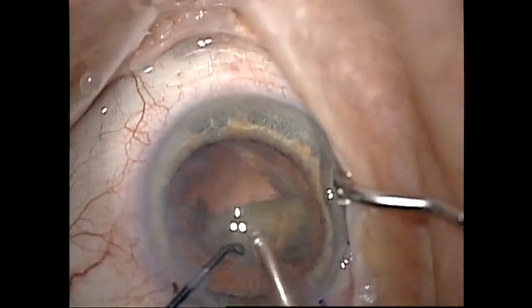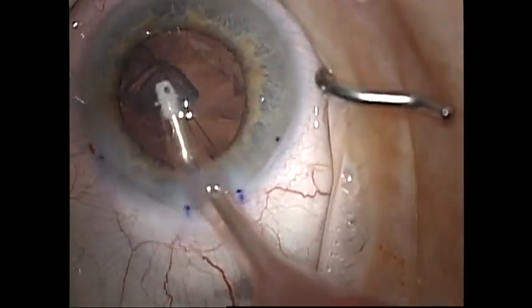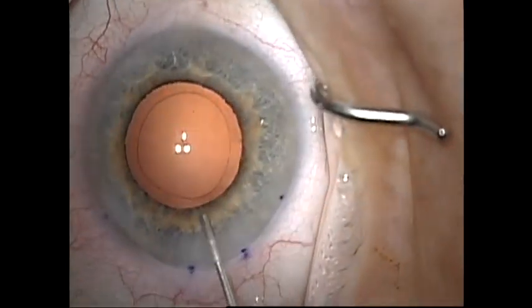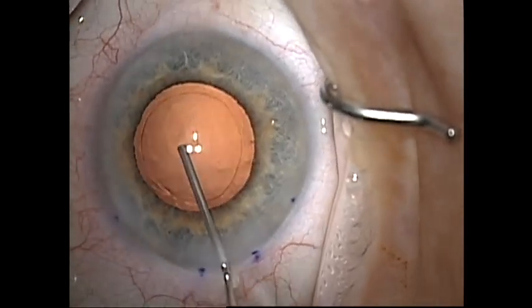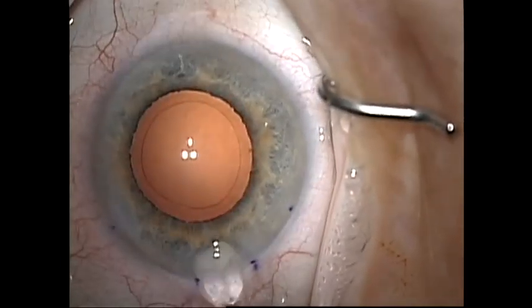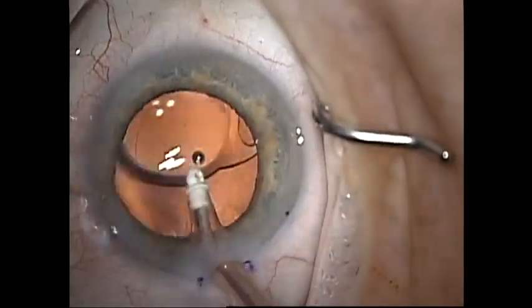The cataract surgery itself proceeds in a usual manner. I do find chopping techniques to be useful when working through a small capsulorhexis. I inflate the capsular bag with a cohesive viscoelastic to prepare for injecting the intraocular lens. I recommend use of a hydrophobic acrylic intraocular lens. Hydrophilic lenses have been reported to have calcification when exposed to air or gas in some cases.